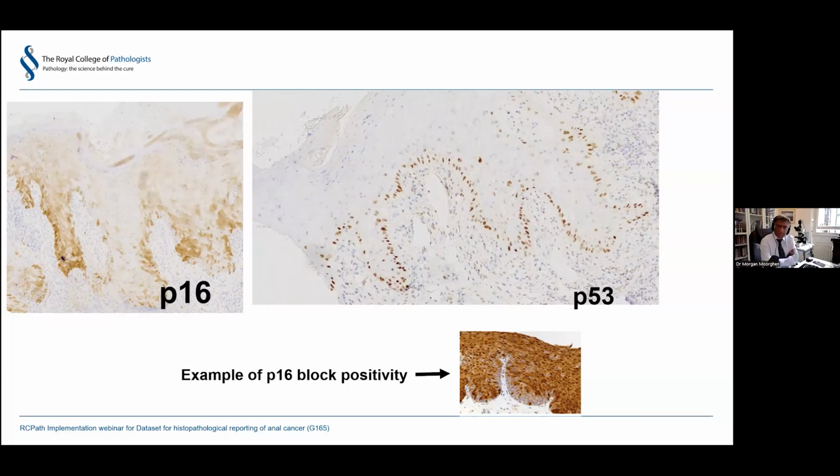And then the p53, well, you should only get 1 or 2 cells staining with p53 in the basal epithelium, and it should be faint, kind of smooth, rather than strong and granular. Admittedly, here it's only a single row, but ideally you want to get more than 1 row staining, and it ought to really hit you in the face. And then this is a feature of this particular condition.